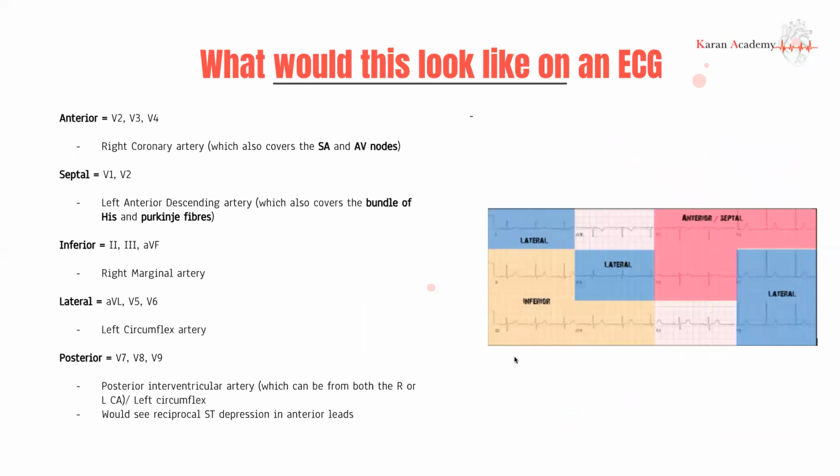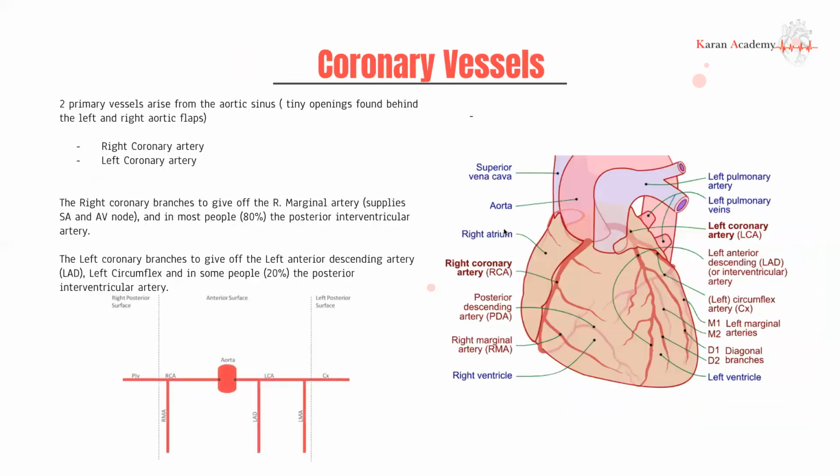So let's look at just a case here. So don't look at this just yet because it's not relevant, but just looking at this ECG, as you can see, most of the deflection in lead one is positive, right? When we don't really have dips bigger than the ups. So this means that lead one is positive. Oops, went back a few slides.